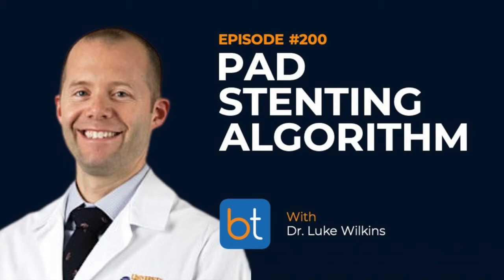The way that I've had more success is by boring through a CTO. Sometimes with more weighted tip guide wires, you can bore through a CTO just by pulverizing through that occluded vessel. There are also crossing devices, and this is on our flowchart. Consider a crossing device. I do not use crossing devices in my practice. A lot of people report success with crossing devices and use them religiously. I'm just not one of those people.